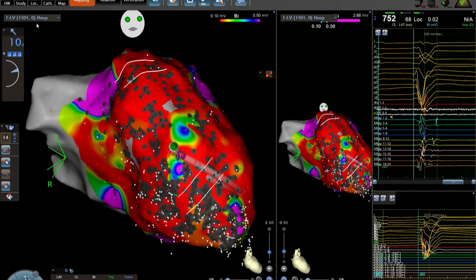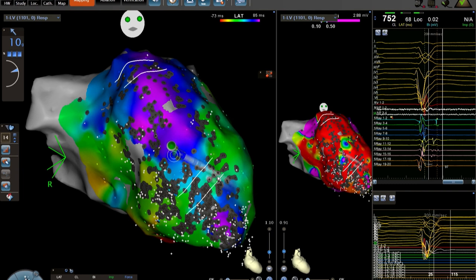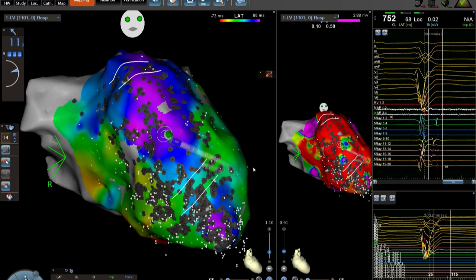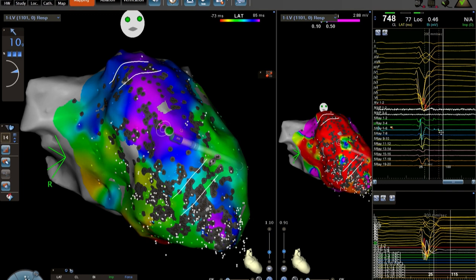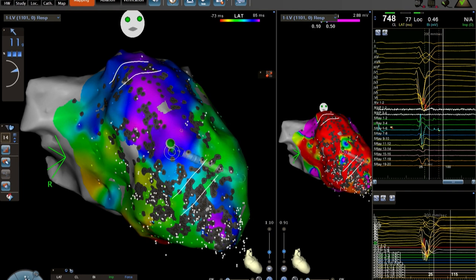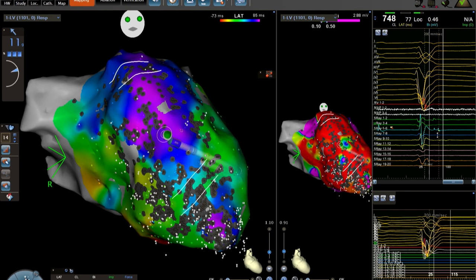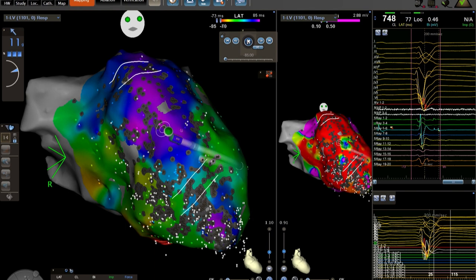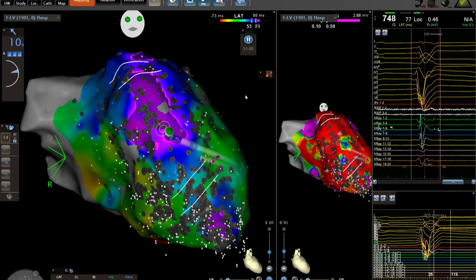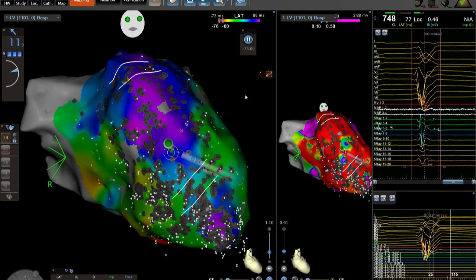Switching to the LAT map: we create the map by closing the window of interest after the QRS to map the near field, avoiding far field. The wavefront in this patient with baseline LBBB - looking at propagation - there appears to be a channel in the mid inferior wall to apex that spreads north and south to activate areas of late activation. There's also something coming from the top. After collecting enough points in about 20 minutes, running the propagation map.